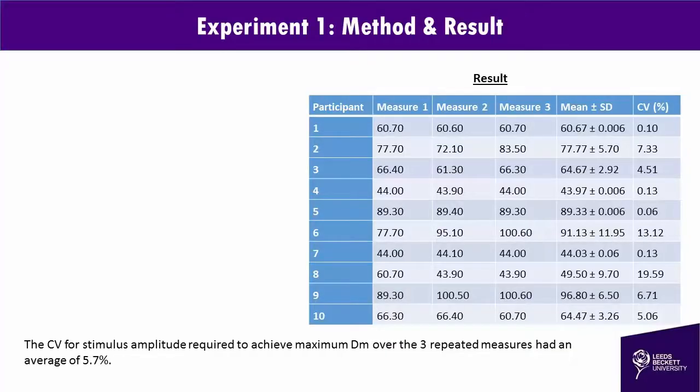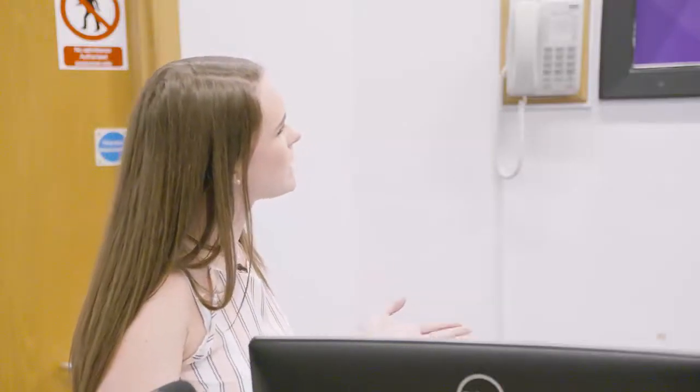I don't know, because clearly you can see the first participant, the coefficient of variation. I mean, there's not that there's any problem with 3 points, but 3 points are just about enough to make a straight line. That looks quite consistent, and then of course you get to the second and the sixth and the eighth, and it goes even up to the 20%. So we've got a range of around 0.06 to around 20, so we've got 19.5% variation.